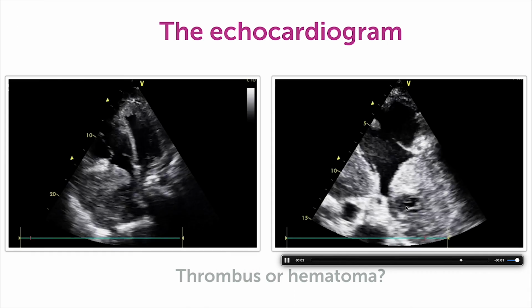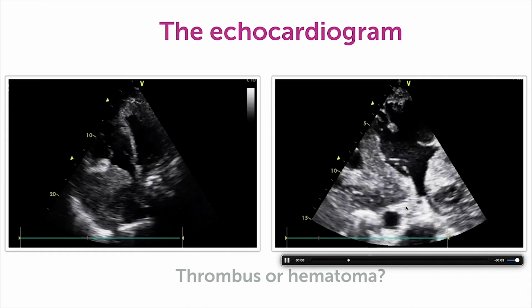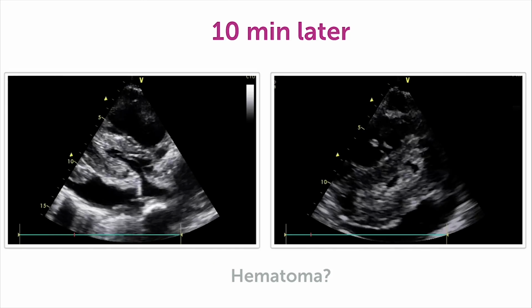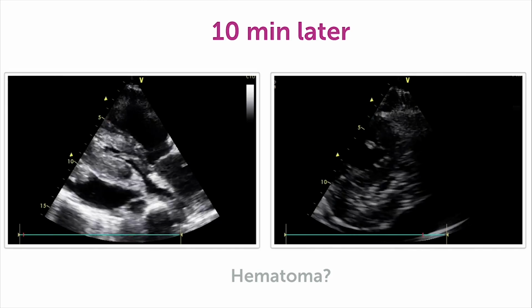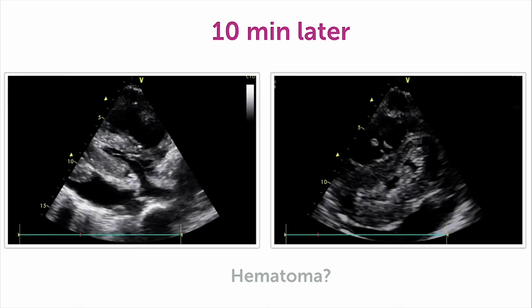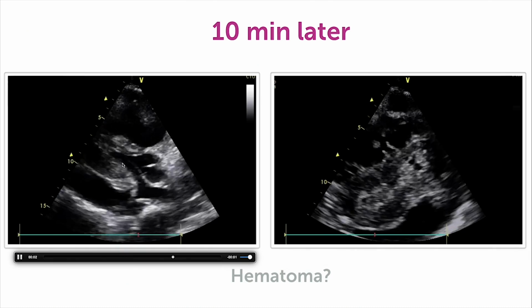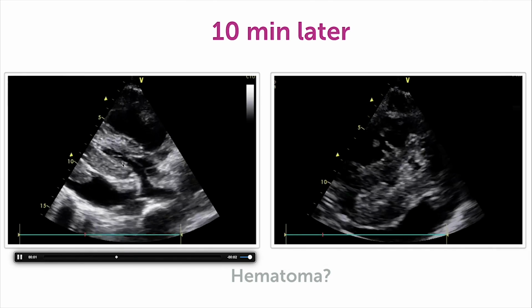A complication of surgery: there was a leak somewhere from the cannula or some other bleeding into the pericardial sac, and those are pretty dramatic echo images. You can imagine how the patient was actually doing. A catastrophic echo, almost no left ventricle volume here. It looks absolutely catastrophic.